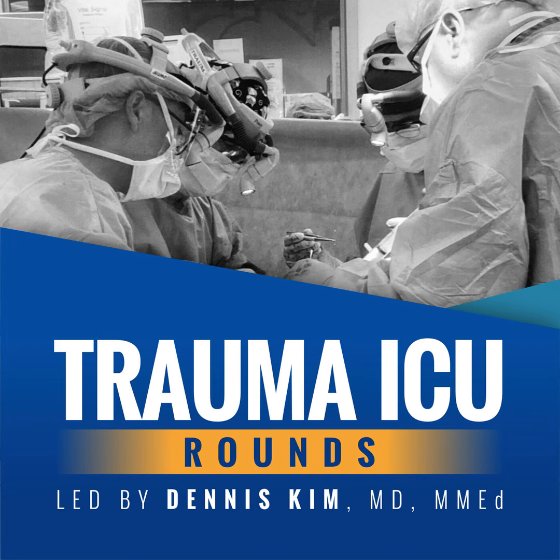And these days, most patients that go on to an SBT aren't weaned to an SBT. In general, patients are placed on pressure support ventilation in an effort to overcome some of the resistive work that needs to be overcome in the process of breathing spontaneously. And in general, 30-minute SBT trials are just as effective as 120-minute trials in determining readiness for extubation.